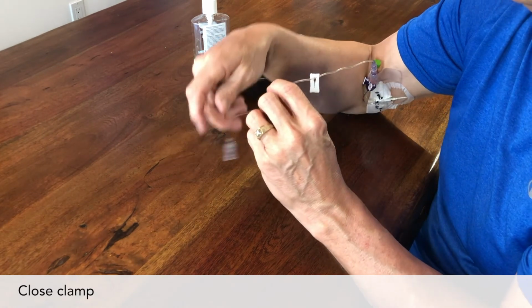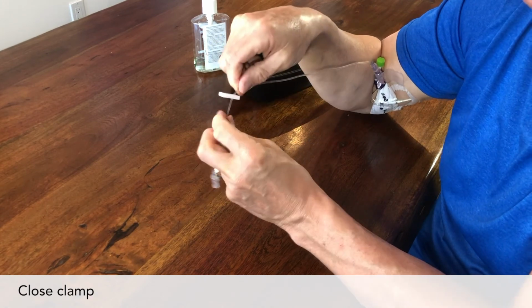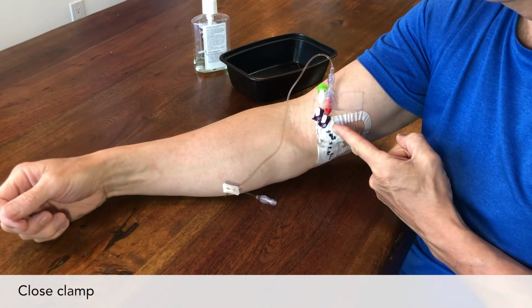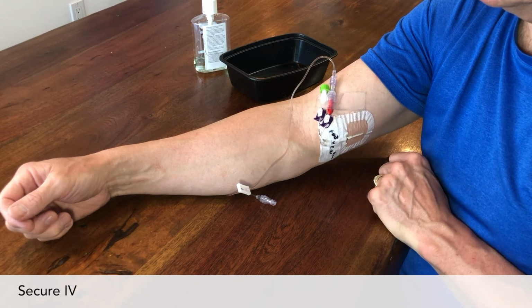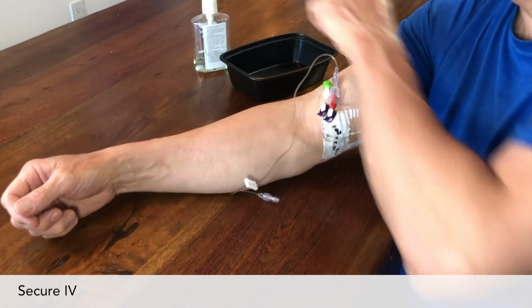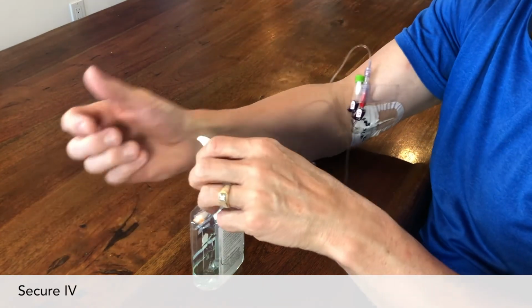Now, if there's a clamp on your IV, you need to pinch it closed now. Not all types of IVs or PICCs have clamps. You need to protect your IV. You can wrap it in a stocking if that's what you were shown, or you could use a piece of tape if you wanted to. But remember never to put tape over the bandage.